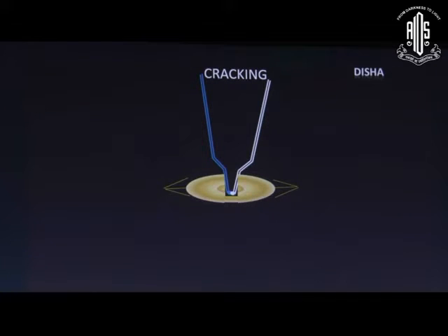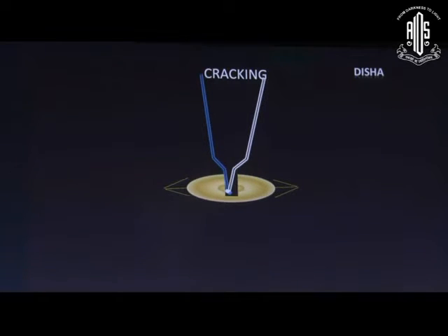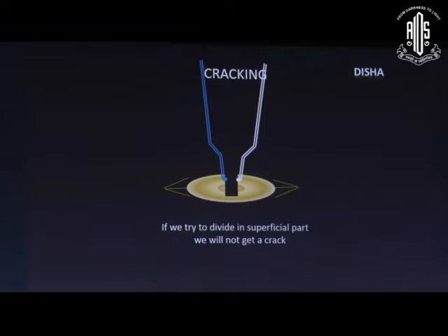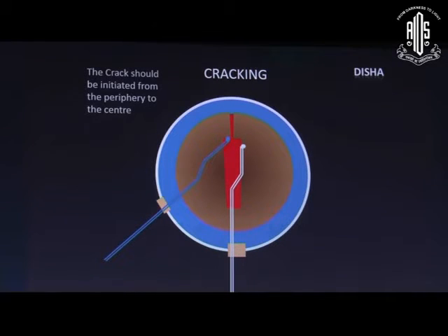We are now coming to cracking. While cracking, place the two instruments at the deeper part of the trench and apply equal force on either side at the deeper part of the tunnel. If we use more force in one direction, that will create traction on the opposite zonule. If we try to divide the superficial part, it will not crack.